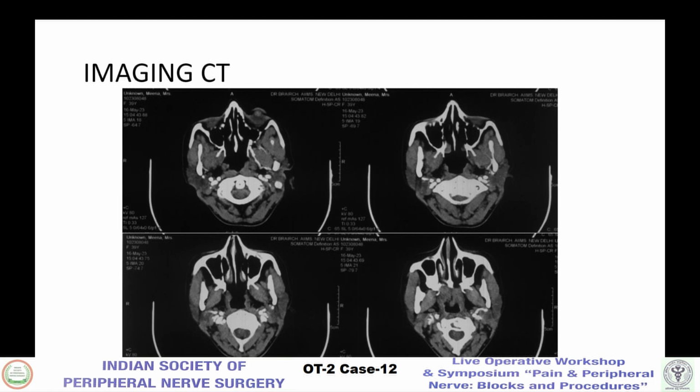Yeah. So if you can see that C2 has a thickening and the canal is severely narrowed here. Yes. But this is not a bony window. Of course, there is a, but then suddenly here, it is a normal caliber. And then here also, if you see, there is some lytic lesion going on. The patient says that this lesion has been there for many years and has not changed with serial investigation. I don't know if radionuclide scanning or something was done, because there's no record over here.